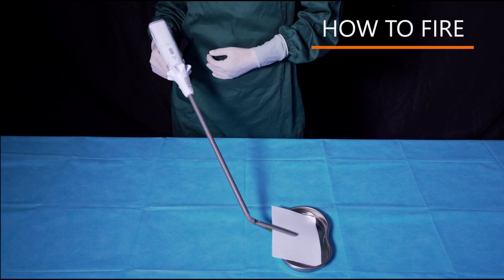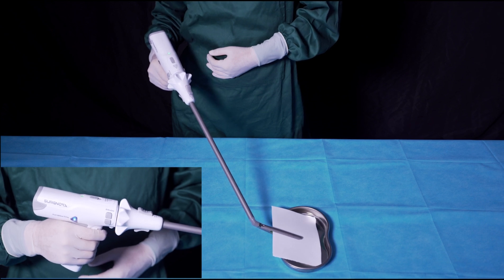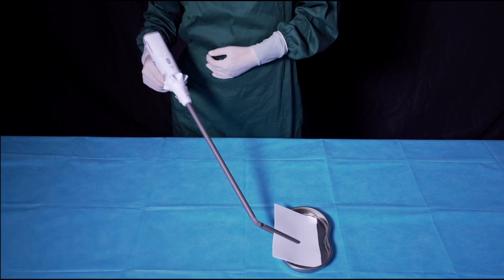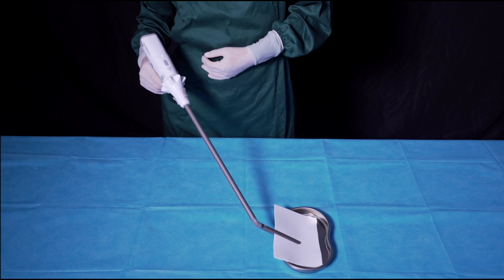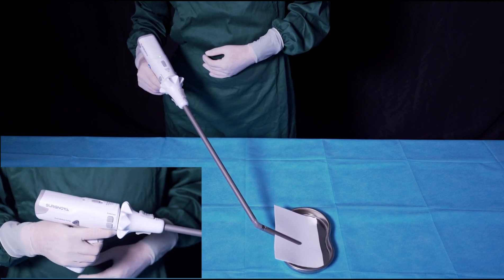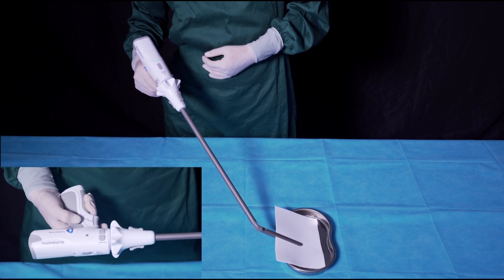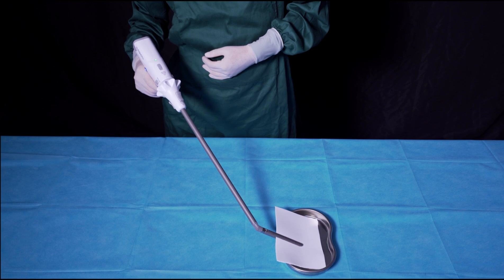After confirming the position of the jaws is correct, long press the close button to close the jaws. After the jaws are fully closed, the insurance button indicator flashes blue. When preparing to fire, press the insurance button left or right to release the insurance to start firing.